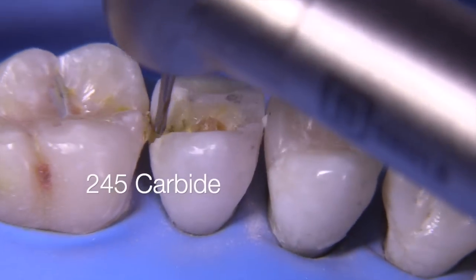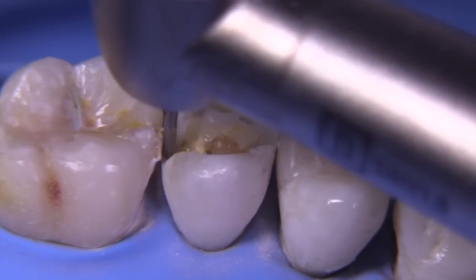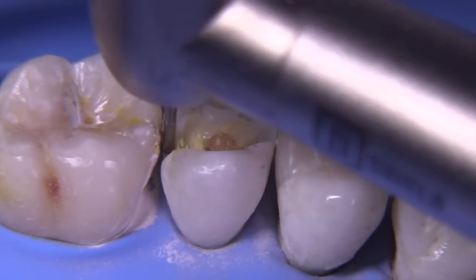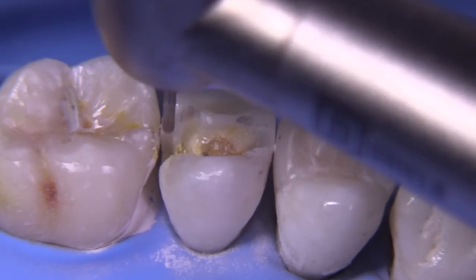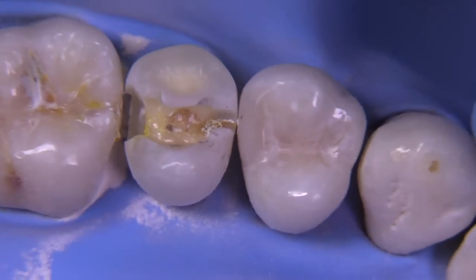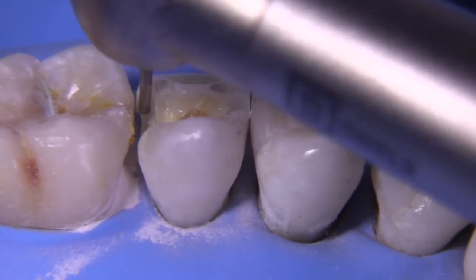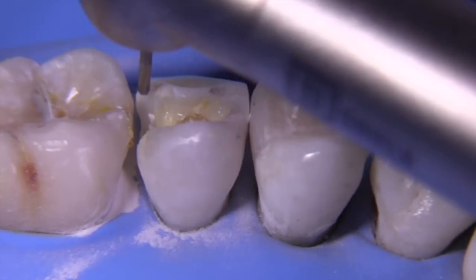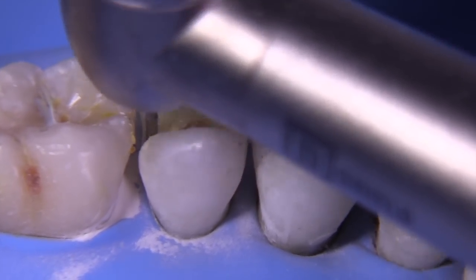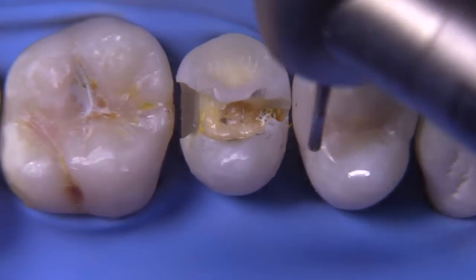Knowing that we have to drop a box, we're going to use the 245 carbide to establish our boxes. We don't always have to break contact with composites, but I'm going to do it here because on board examinations — particularly on the American boards — interproximal contacts must be broken. Just like we do with any Class 2, we work at it carefully and a little bit slowly until we achieve the broken contact on both the facial and lingual. The 245 bur is pretty small, so you don't have to worry about hitting the adjacent tooth too much.